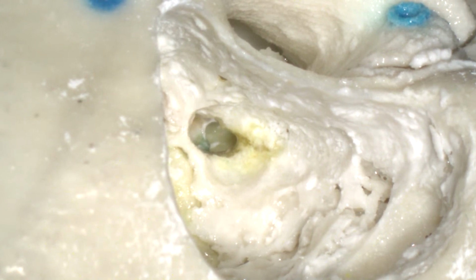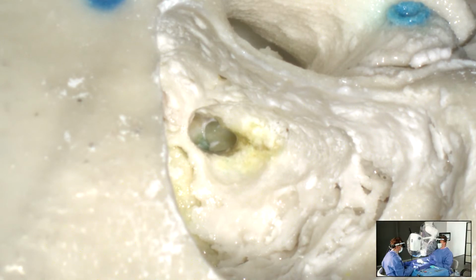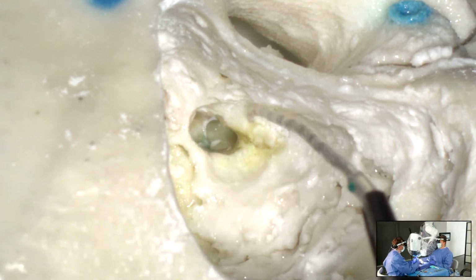So it's easy now to take the electrode and bring it into the surgical field. Now you look underneath, right? You look on the electrode, how to touch the implant. Yes. And at the same time you have the view to the surgical area, right? Yes, that's right. So it's easy to handle.